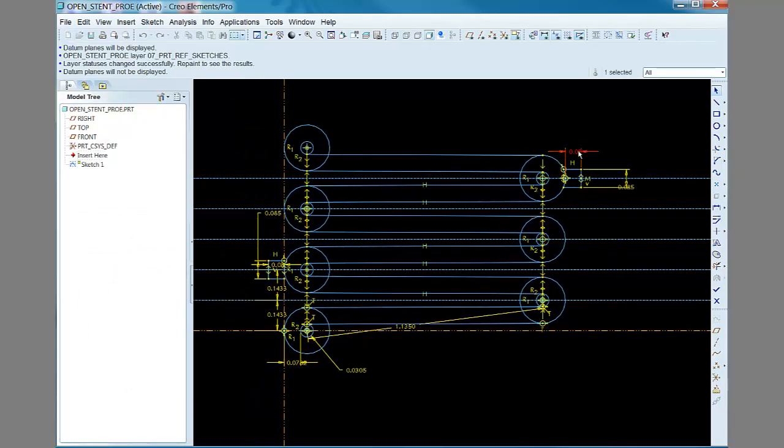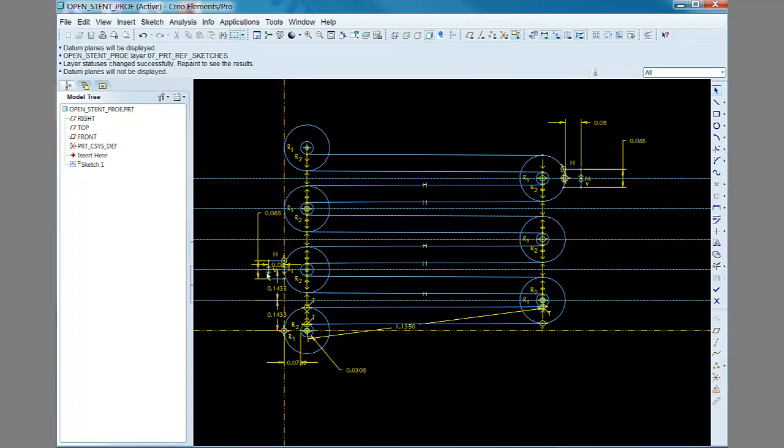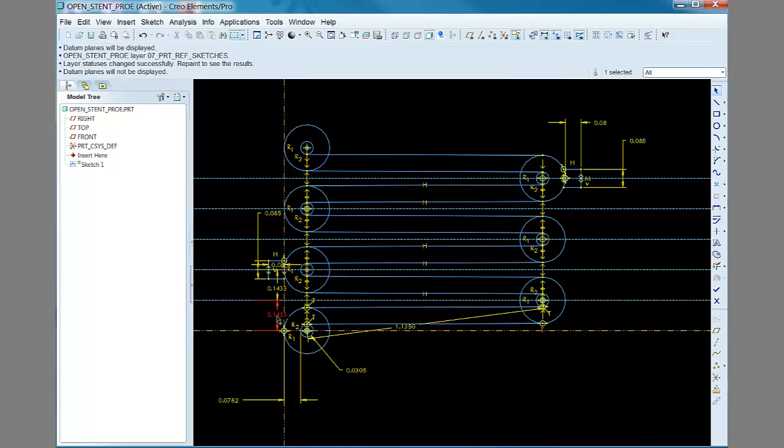I tried to use as much symmetry in the sketch as possible to minimize the number of dimensions and that way better keep track of the unit cell's shape, and also to simplify the sketch.